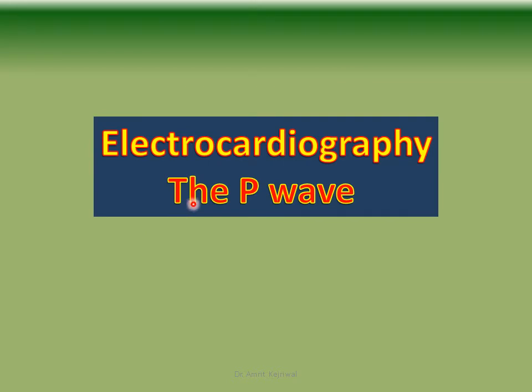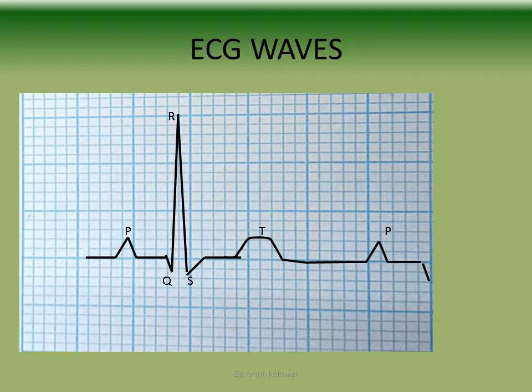Today we learn something about electrocardiography, the P wave. Channel's name is Heartbeat. My name is Dr. Amrit Kejriwal. These are the basic waves on the ECG: P, Q, R, S, T and again the P. These have been discussed in the previous videos.